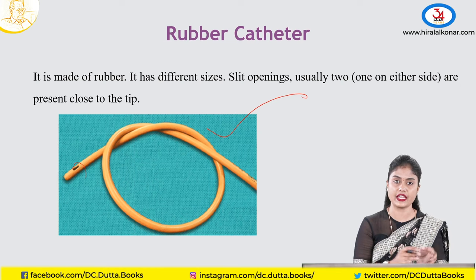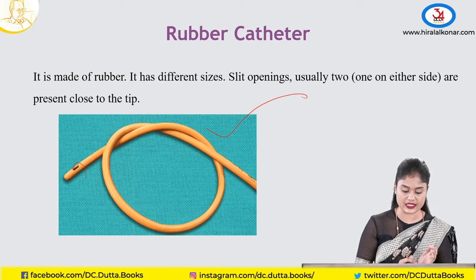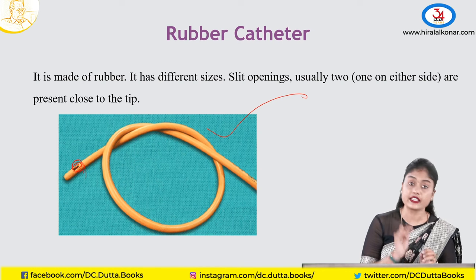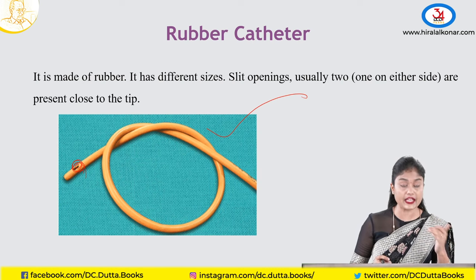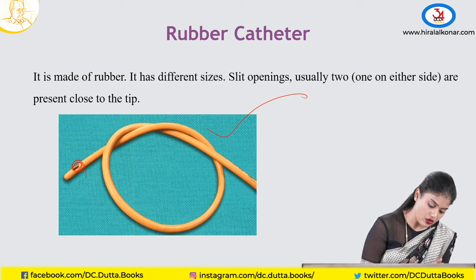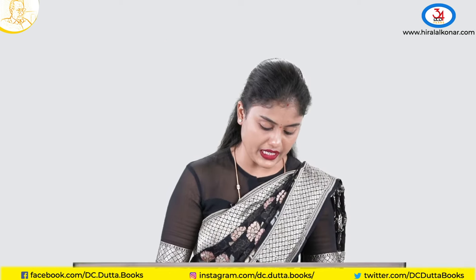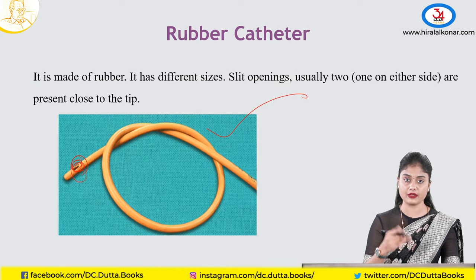For pediatrics, they use 8 French also. There is a slit opening at the tip of the instrument — you can see it here. That helps you to drain the bladder. There will be two slit openings on either side of the catheter, which helps to drain the bladder.